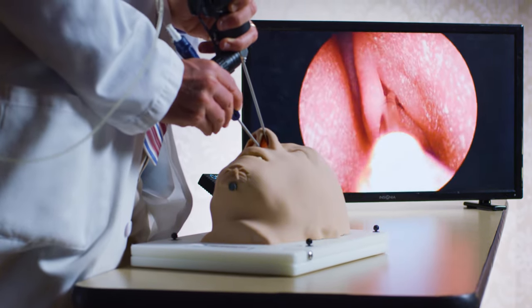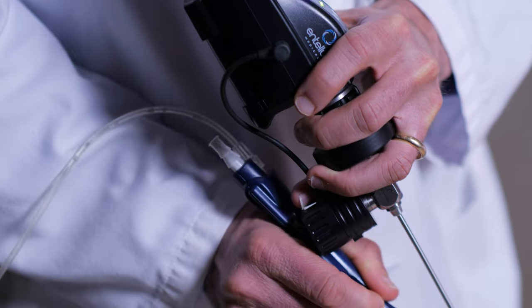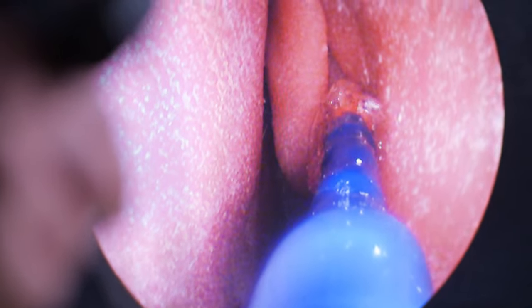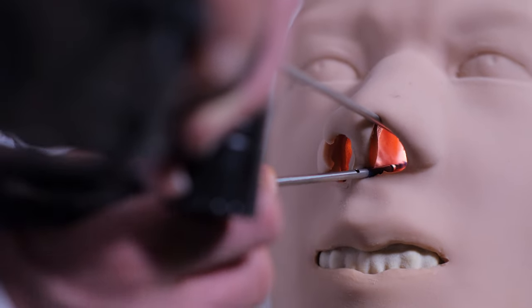The balloon sinuplasty procedure involves providing numbing medications inside the nose. Then I'll use a small camera to go inside the nose and get a clear picture of all the structures inside. Then I'll insert a small device into the nose and into the natural opening of each sinus. This device has a balloon on it that will advance into the sinus and dilate.